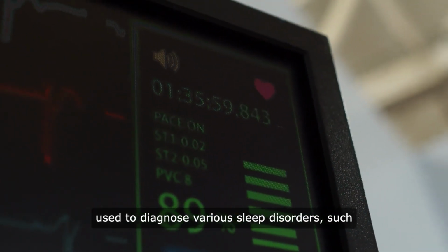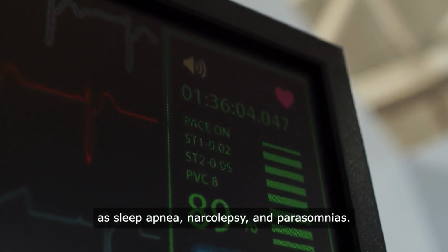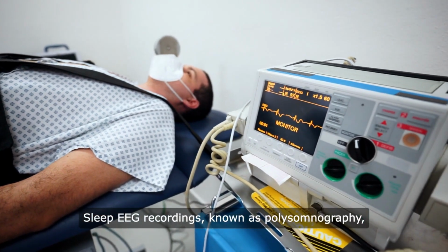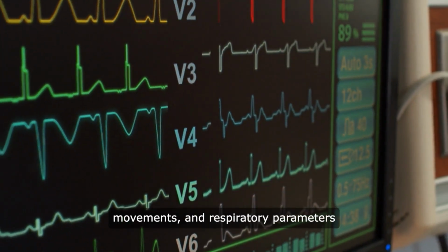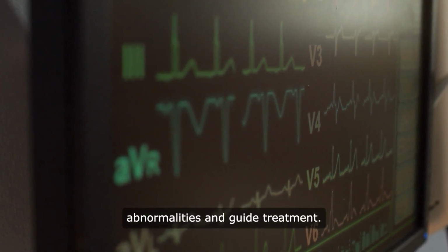EEG testing is used to diagnose various sleep disorders, such as sleep apnea, narcolepsy, and parasomnias. Sleep EEG recordings, known as polysomnography, assess brain wave activity, muscle tone, eye movements, and respiratory parameters during sleep to identify abnormalities and guide treatment.